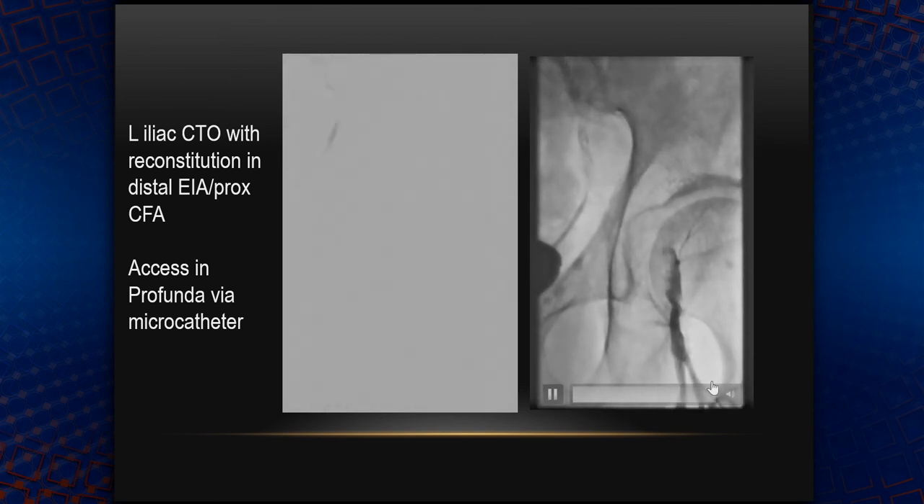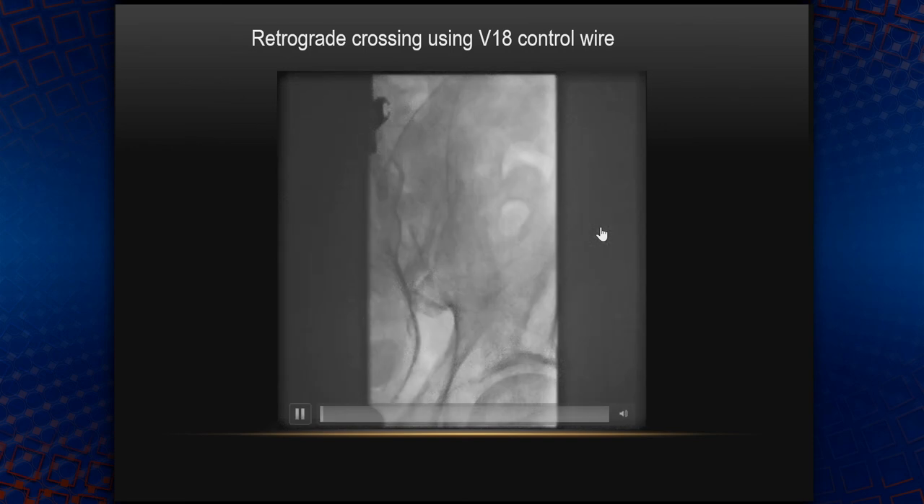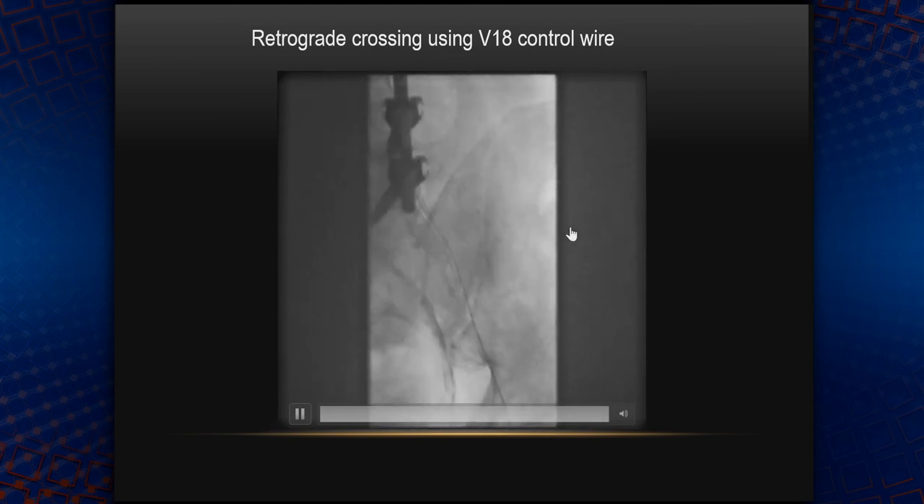That's why I punctured the profunda here with a micro puncture kit, put the micro catheter in, then took a V18 Control wire. You see it going up, advancing, looking for a possible channel. I decided to go from below rather than from above because of the steep angle of the iliac. The wire prolapsed and I just pushed it — got lucky — it went straight into the aorta.